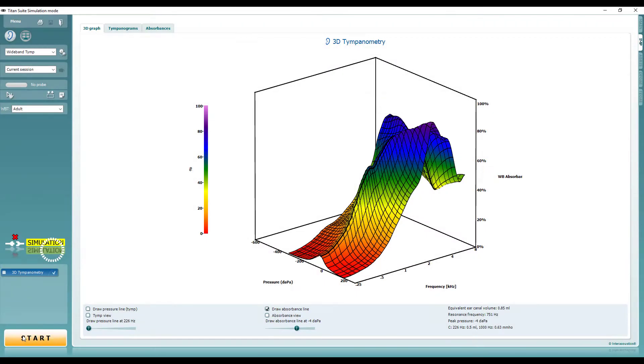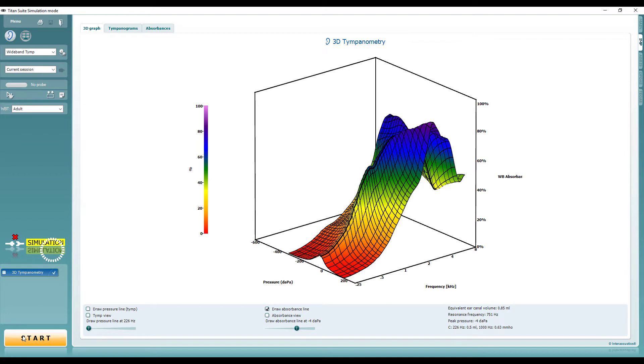If the 3D tympanogram displays excessive yellow and orange in the higher frequencies, this is an indication of an abnormality. Likewise, if the lower frequencies are predominantly green, blue or purple, this is not the expected result.